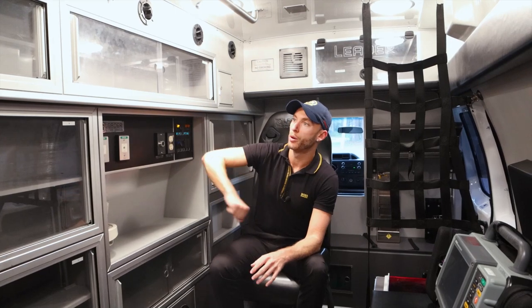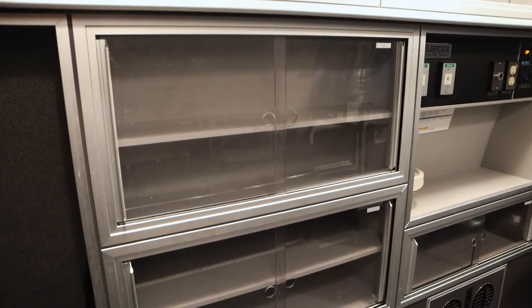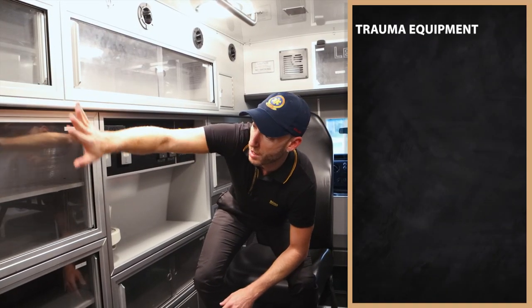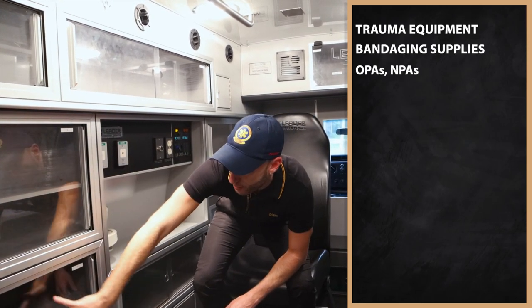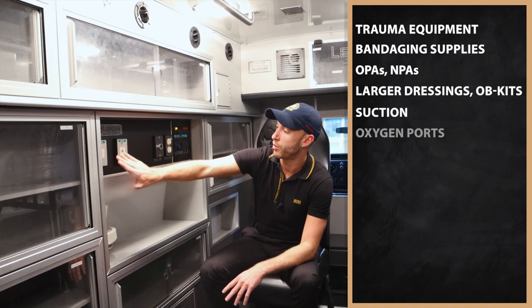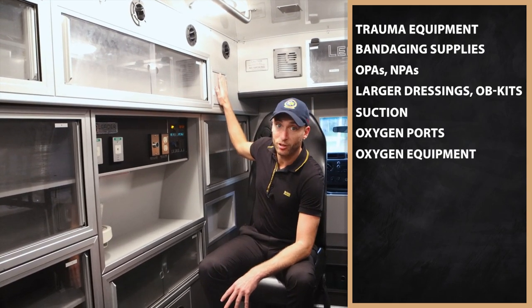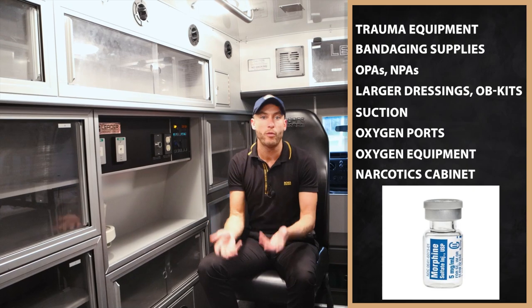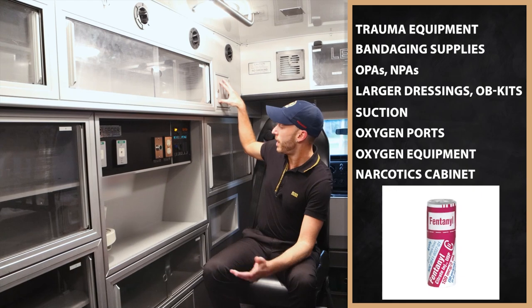Now let's go through some of this. So first we have a lot of cabinets. To give you an example of a setup, this could be trauma equipment — a lot of like bandaging supplies, OPAs, NPAs. This could be where we have larger dressings, OB kits. We have suction over here. This is where the oxygen ports are — this would be all of our oxygen equipment. This is actually the narcotics cabinet. Right here is where the narcotics go — our morphine, our Versed, our Ativan, Valium, fentanyl, stuff like that.